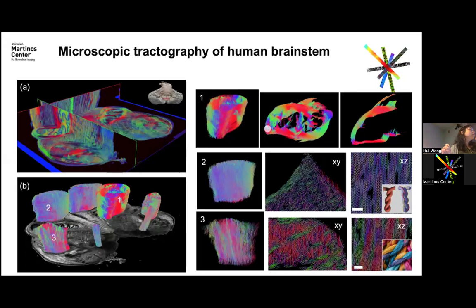There's a lot of colors here, so are you saying that because of this behavior, that's why you see all sorts of colors? You mean like this one? That seems to be, yeah. I think they really represent the different fiber bundles.